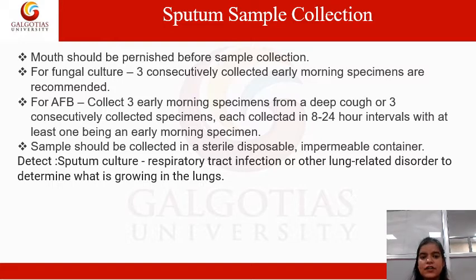For fungal culture, 3 consecutively collected early morning specimens are recommended. For AFB, collect 3 consecutive specimens, each collected at 8 to 24 hour intervals, with at least one being an early morning specimen.